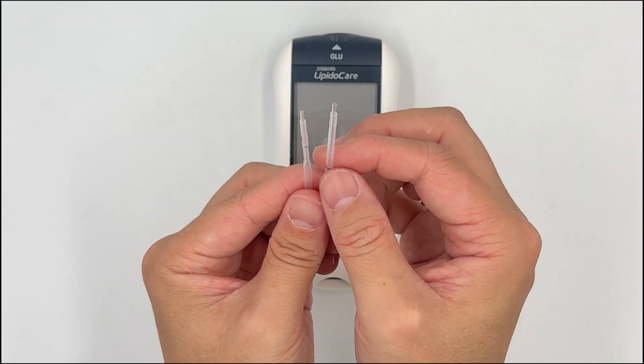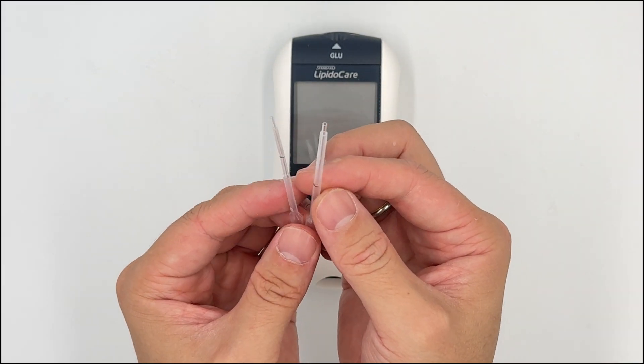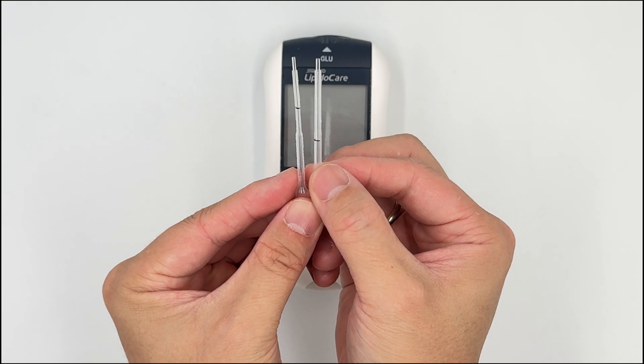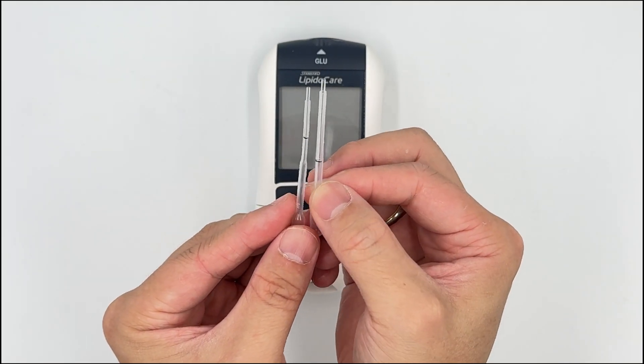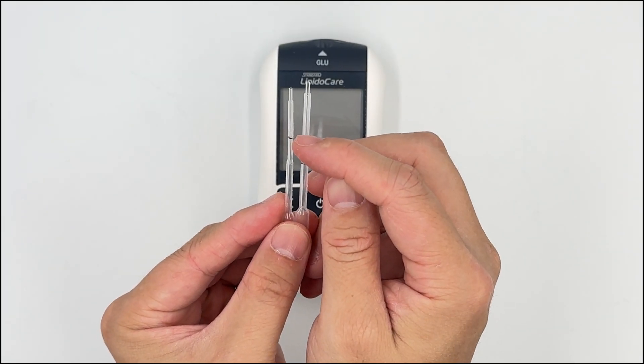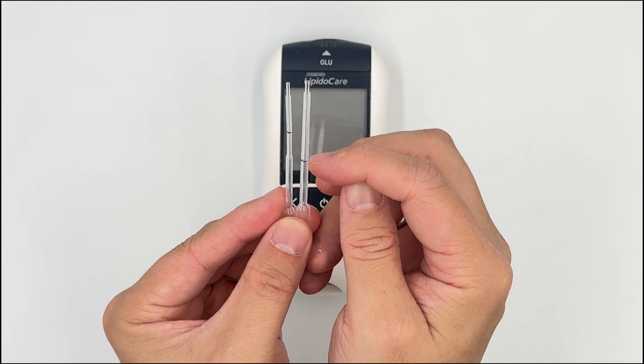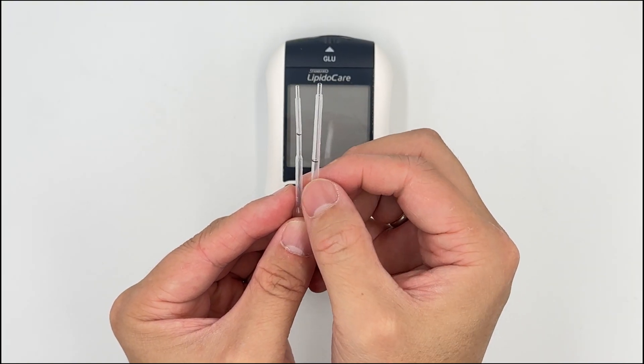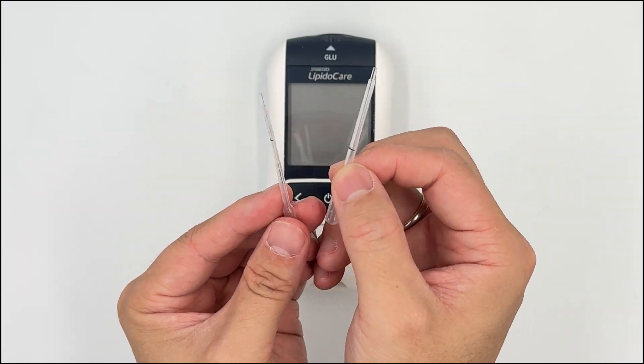Tip number one is regarding the easy tube. There are two types of easy tube: one for total cholesterol, which is a bit shorter — you can see the black line here — and the other for the lipid profile, which is a bit longer — you can see the black line here. Do not interchange and interuse them.